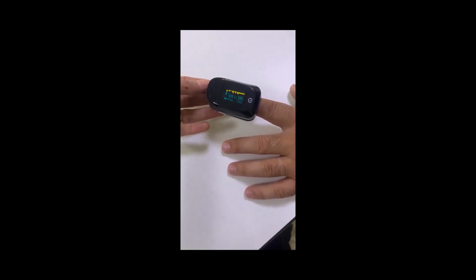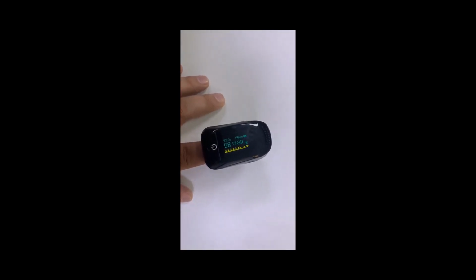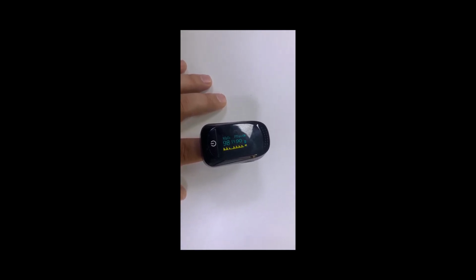The SpO2 result here is 98% and the pulse rate is 89, and this is our result. We will compare it with normal and see if it's normal or not. As we see, it's normal.